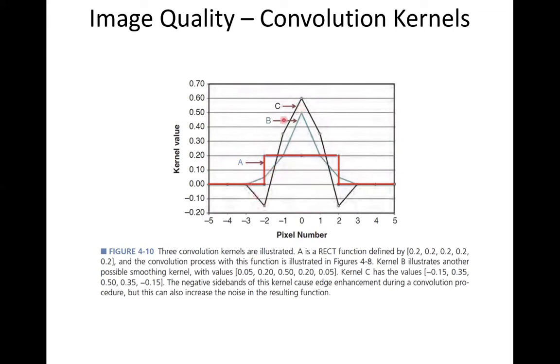And then there's this, which is basically a sinc function that averages this with actually negative values, or a trough on the outer points. You wonder, like, why would you ever use this one with the trough? Well, it turns out the Fourier transform of this sinc function in the spatial frequency domain is itself a rectangle. And so what it does is it cuts off frequencies above a certain amount and just cuts them off directly.